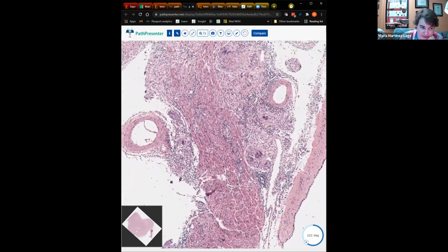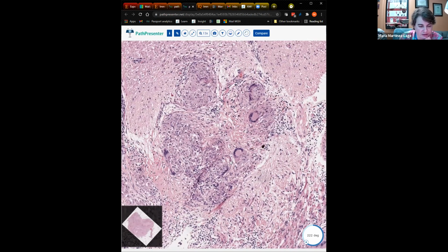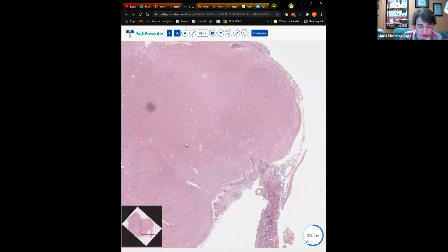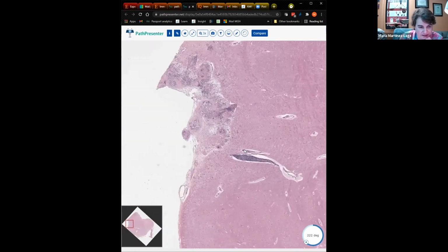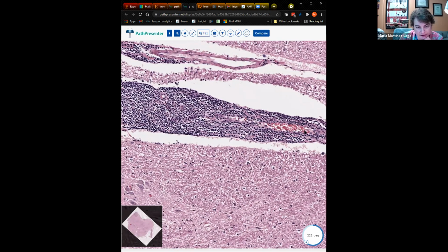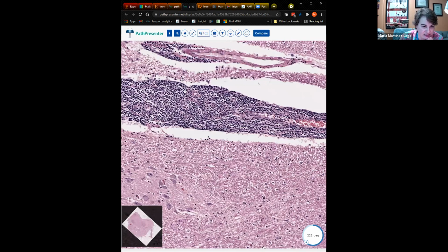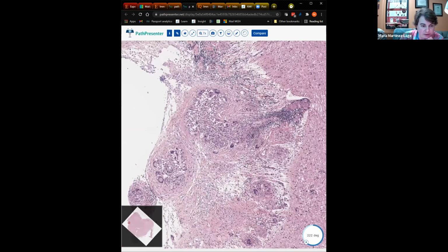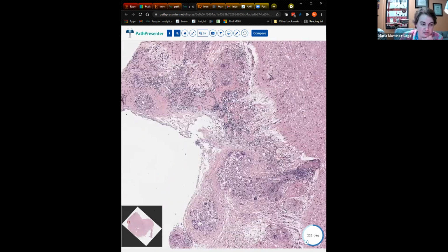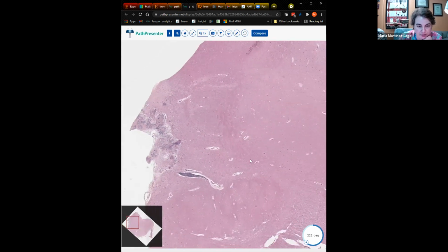Once you've ruled out infections using the best of your abilities, then there's always a possibility that this is sarcoidosis that is affecting the central nervous system. Sarcoidosis does affect the central nervous system not infrequently. It's not very common to have it as the only site of presentation of sarcoidosis. Look here, we can actually see the lymphocytic inflammatory infiltrate that is associated with the granulomatous inflammation. Here's a leptomeningeal vessel, here's perivascular lymphocytes. They all look mature, small, round, so more reactive than anything else. One of the most typical sites of involvement of the CNS by sarcoidosis is the hypothalamic hypophyseal axis, so very typically they will present with diabetes insipidus. But once it does affect the central nervous system, it can occur anywhere.